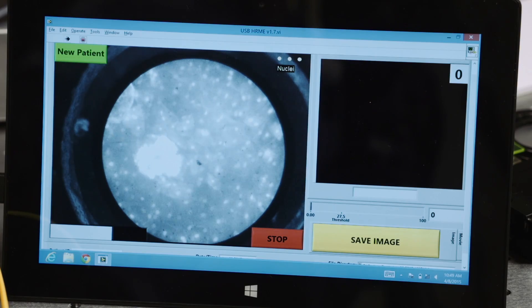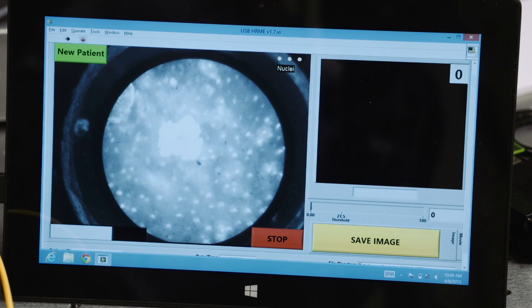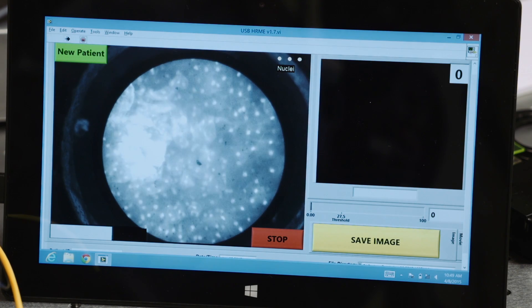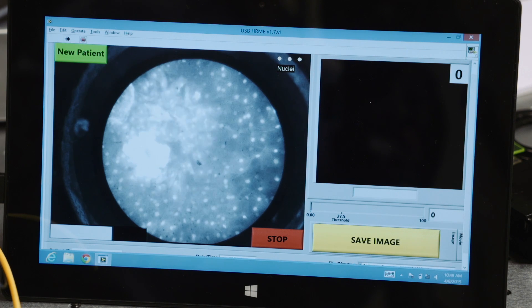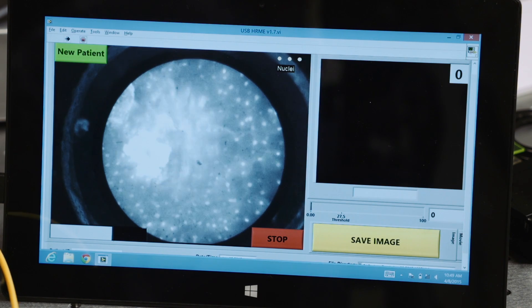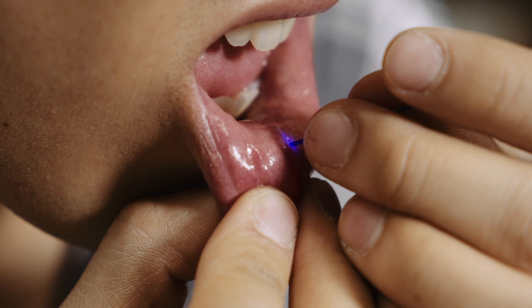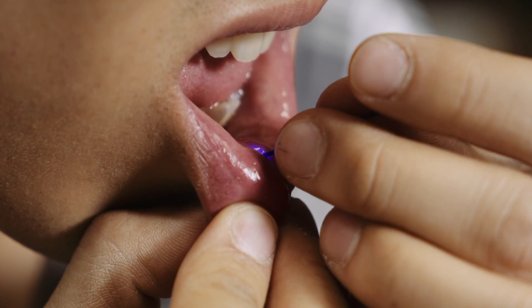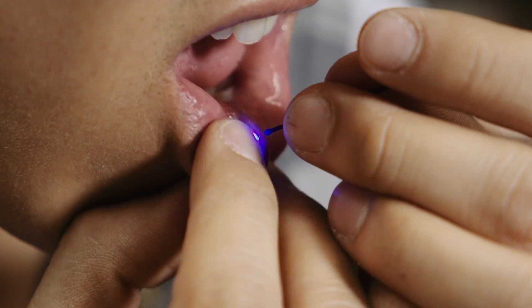We can just apply the probe to the site. We're looking at the cell nuclei in my bottom lip right now. You can see they're all pretty small and evenly spaced, so that indicates normal healthy tissue. The clinician can see this in real time and then assess whether or not they think it's normal or abnormal without having to take a biopsy.